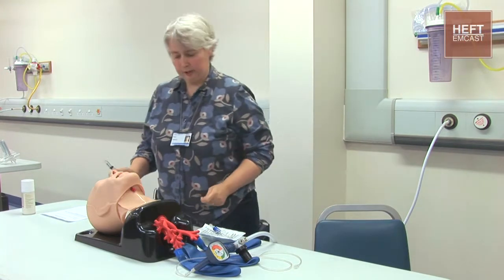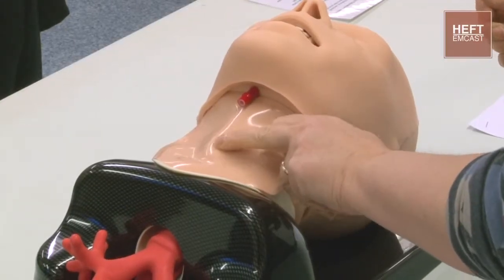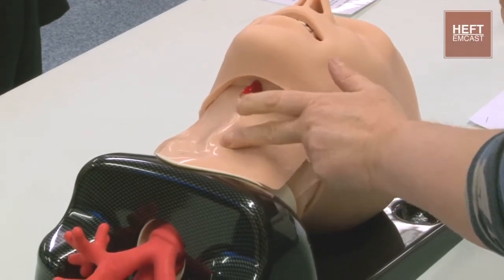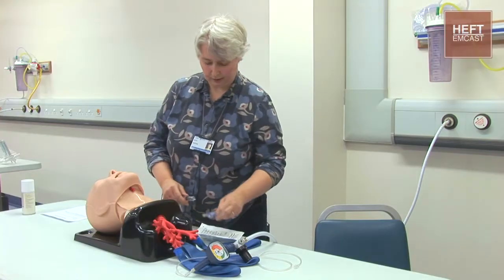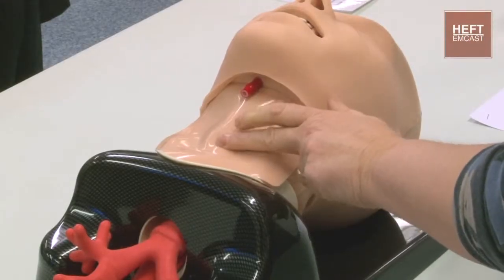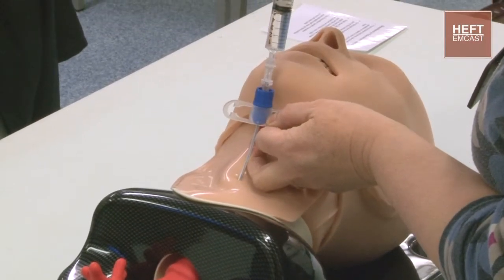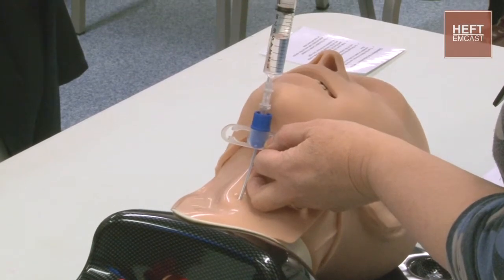You need to identify your landmarks and look for the cricothyroid membrane. I can identify there is a dip — that's the thyroid cartilage, that's the cricoid cartilage, and there is the dip where the membrane is. So I collect it all together, find this space I want to go to, and then in a caudal location I insert it until I get air bubbles, confirming that I'm actually in the trachea.